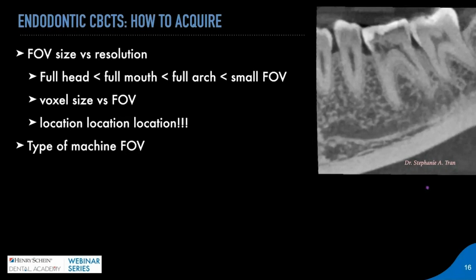Some of it is going to be dependent on the exact software and screens and exact software readers that you use, and then also what kind of CBCT you took. If you want to learn a little bit more about it, you definitely want to talk to your CBCT manufacturers for a lot of the specifics.